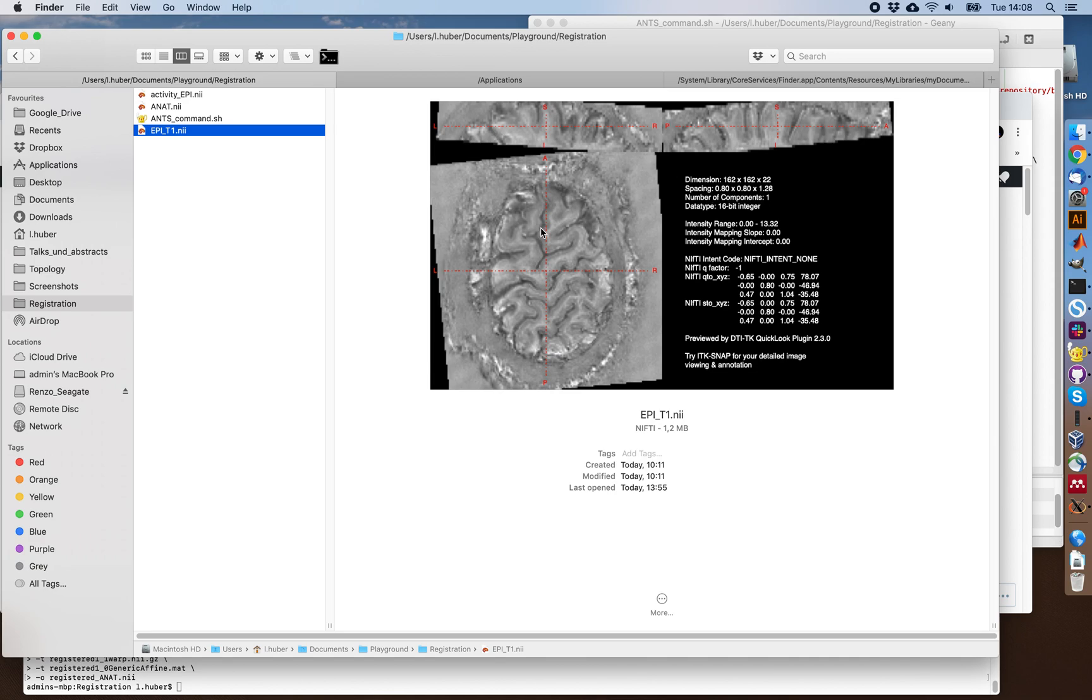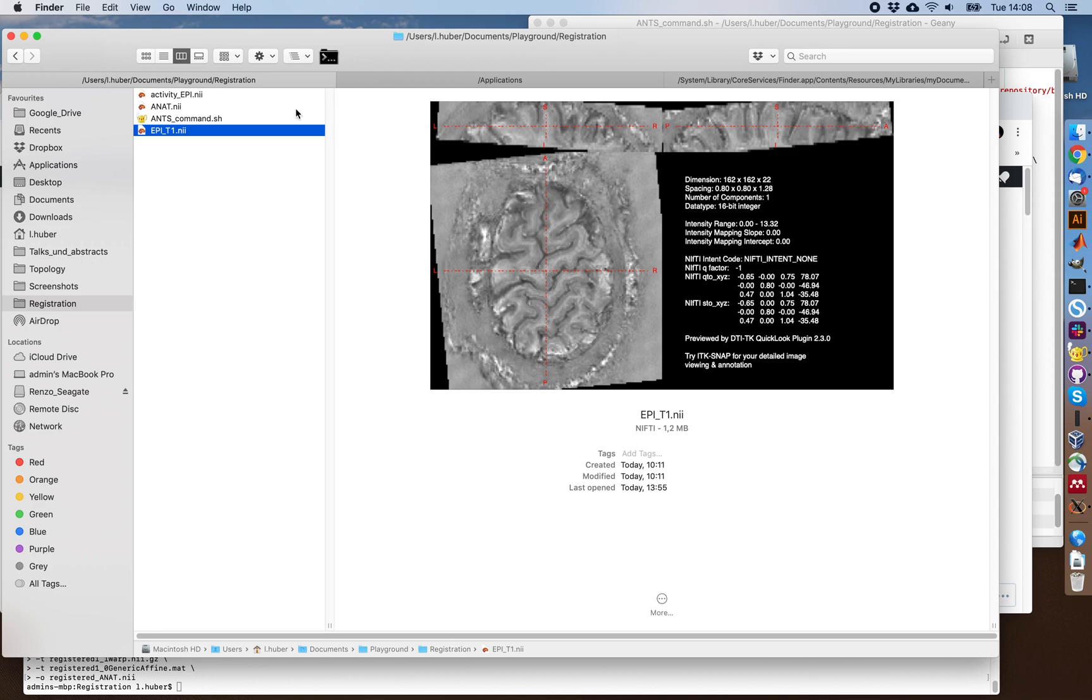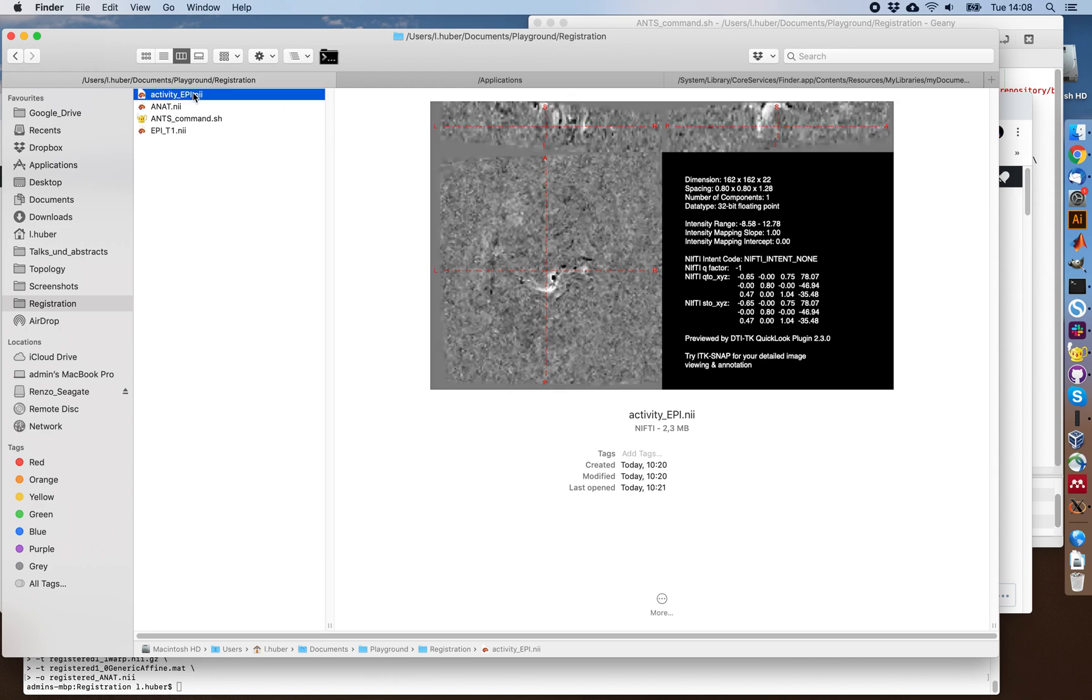This is a mean image of an EPI time series. So it's taken from the entire time series and averaged. The T1-weighted contrast here comes from the additional inversion pulse that is used in specific fMRI contrast like the VASO. And in the same space as the EPI mean, I have the functional activation map also.